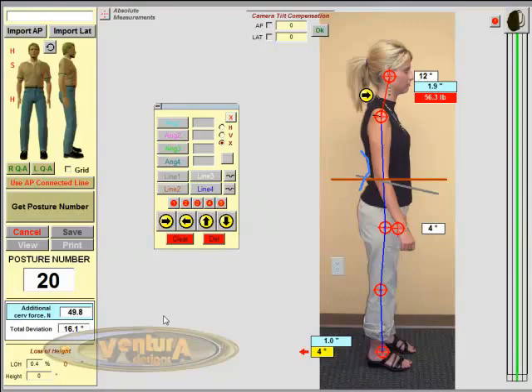Now, the conversion factor of 50 newtons is about 11 pounds of downward compressive forces, if someone needs that conversion factor. But the beautiful point of Posture Pro and all of these numbers that you see on the screen is that each and every number should be 0. And anytime it's not 0, anytime it elevates, that's an indicator of additional forces being placed on the person's body and a limitation in what they're able to accomplish.